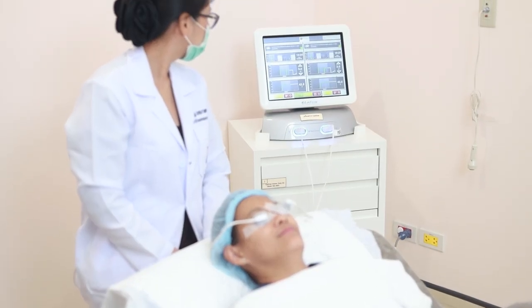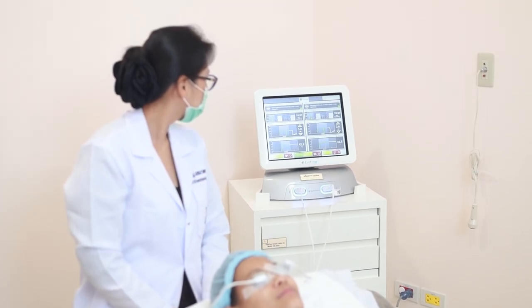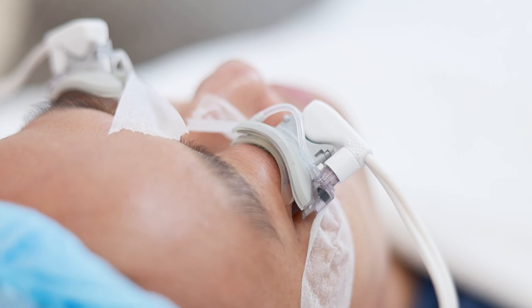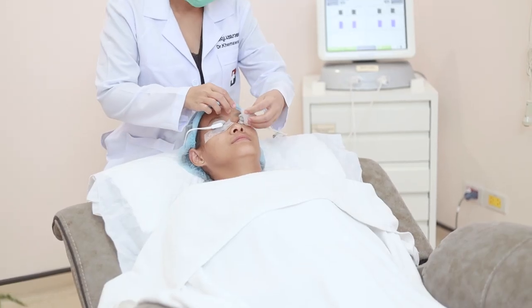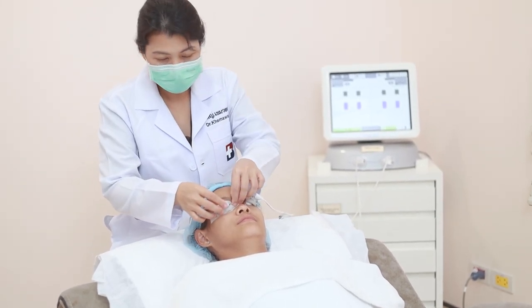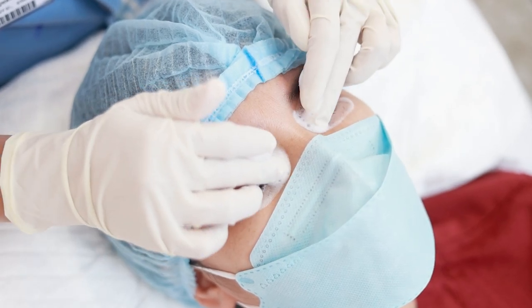There is no pain at all. The machine starts by providing heat and then applies pressure to the eyelid. The heat and pressure take about 12 minutes. After finishing the procedure, we clean the eyelid and check again in front of the machine.